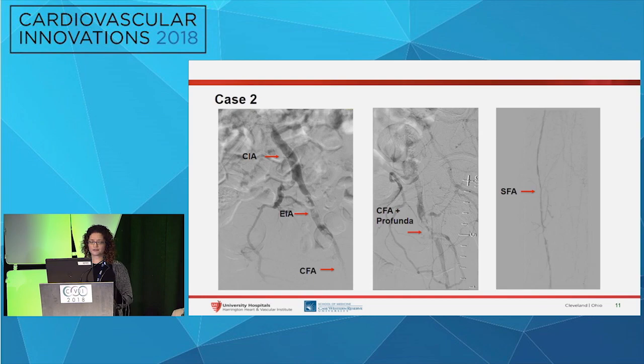In an angiography from a right groin approach, this was with the catheter slightly into the common iliac artery orifice, and there was a pretty dense calcified plaque at the common iliac artery orifice, an otherwise patent common iliac artery, and then very extensive, bulky, heavy calcific disease at the external iliac artery.